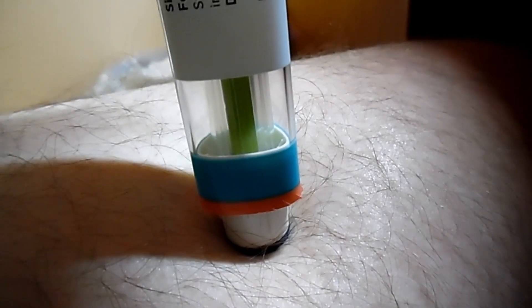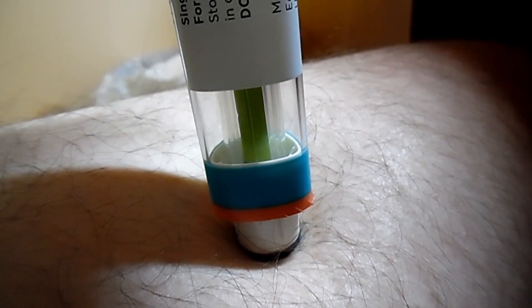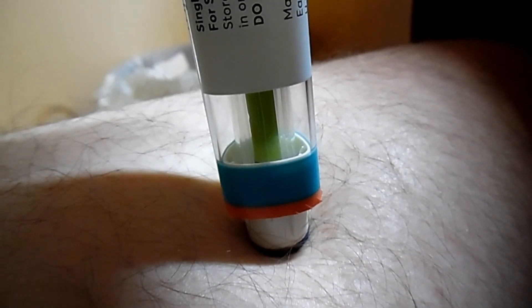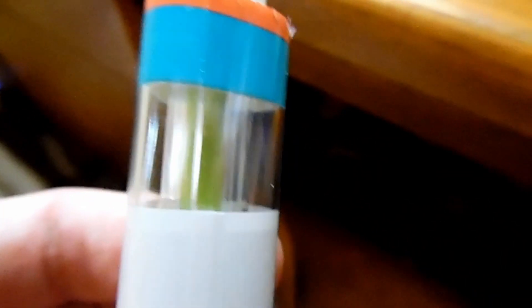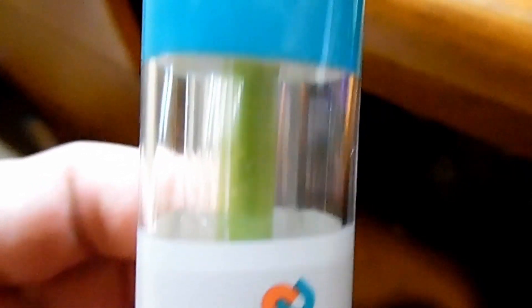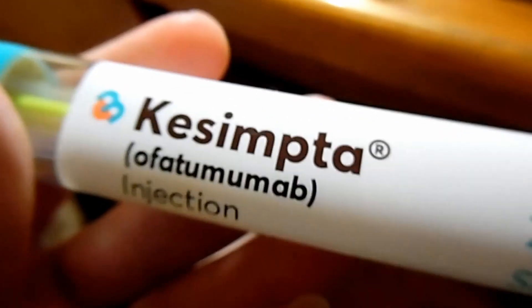I wait about 10 seconds before I lift up the pen. There you go — you can see a little blood. That means it went in, and the tube is green on the inside, which means it completely injected you with the medication and you are done. That is how I inject myself with Kesimpta.